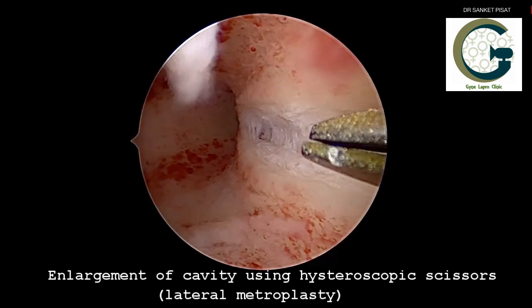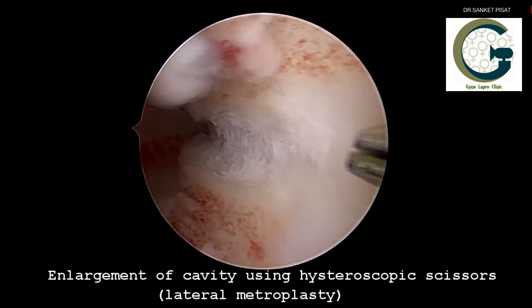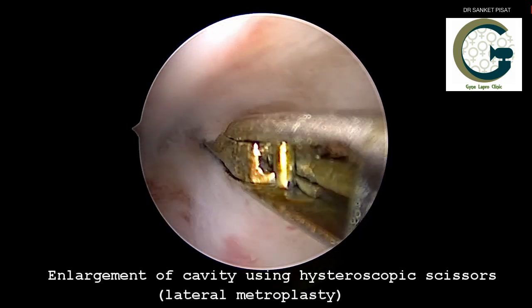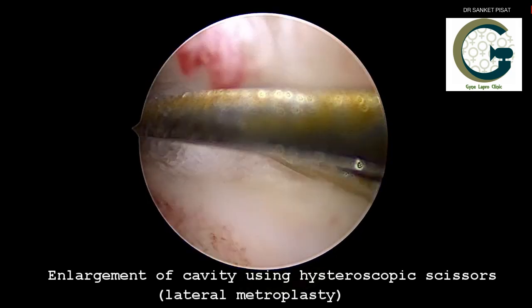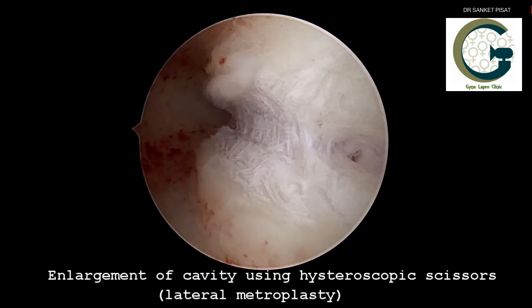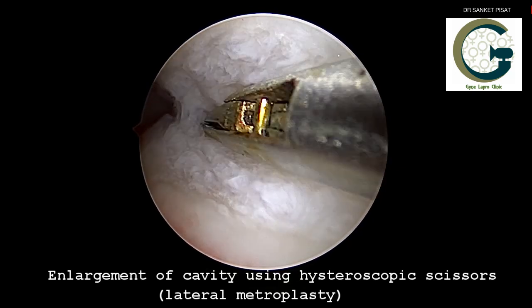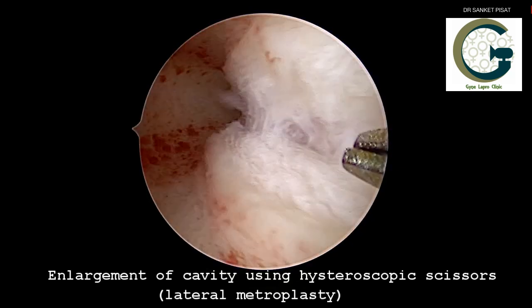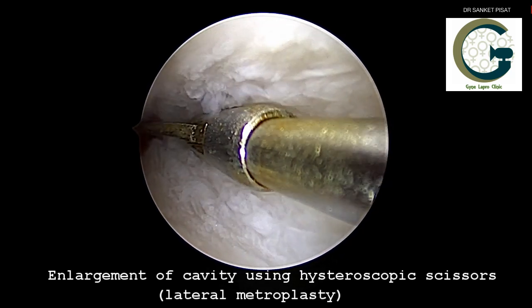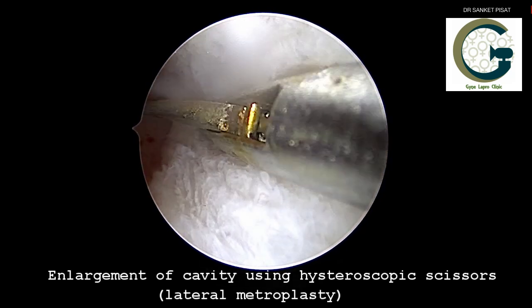Performing hysteroscopic lateral metroplasty has not only been shown to improve pregnancy rates in patients undergoing IVF, but it has also been shown to remarkably improve pregnancy rates in patients who have had prior abortions. There is a significant decrease in the incidence of abortions after this hysteroscopic lateral metroplasty corrective procedure has been done.